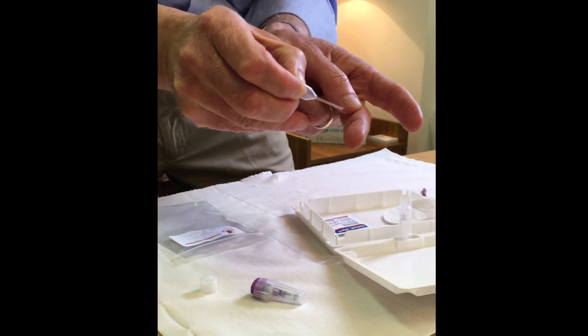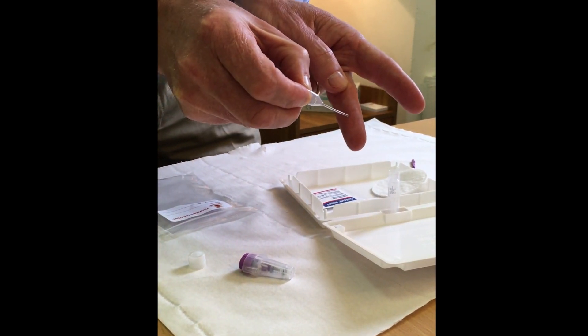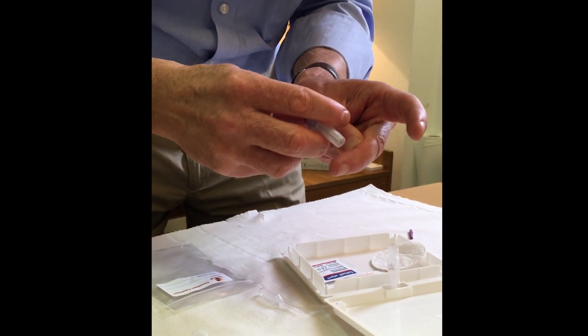When you prick the finger, where we're going to prick is just over the crease, slightly to the side of the center of the finger. I've now pricked the finger just to show you exactly how this works.